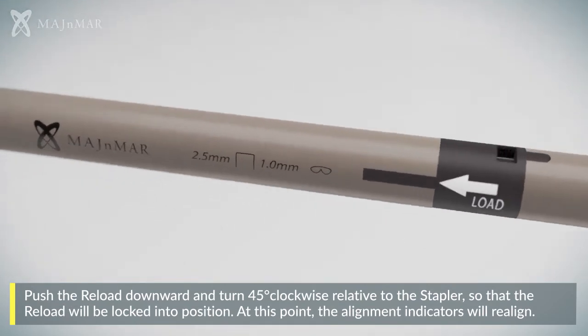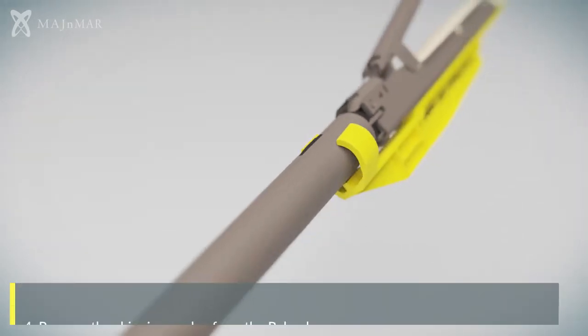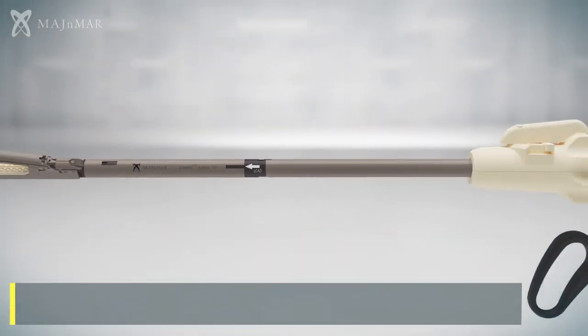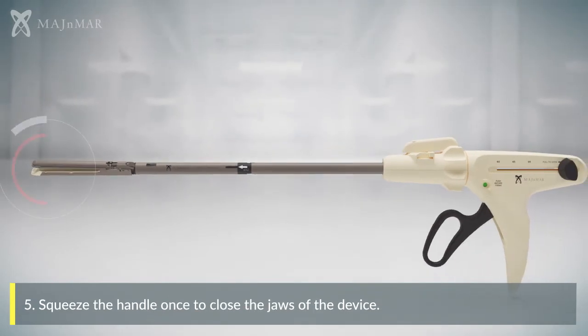At this point, the alignment indicators will realign. Then remove the shipping wedge from the reload and squeeze the handle once to close the jaws of the device.